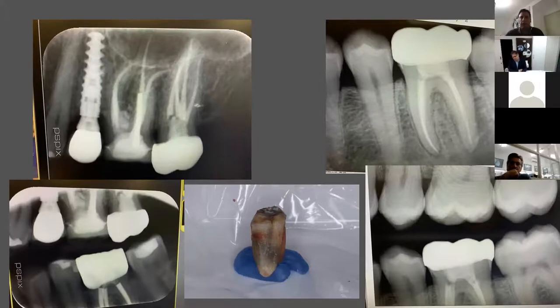Again, it's all about preparation of the tooth and giving the technician enough room. Here's the issue: they do this digitally, right? They've got a milling machine. Harry's marker doesn't work, unfortunately. The milling machine is made to sit on this one and mill it. The trouble is, and Harry will tell you, that he doesn't get good impressions. They don't get good records. They have to try to guess the margins.